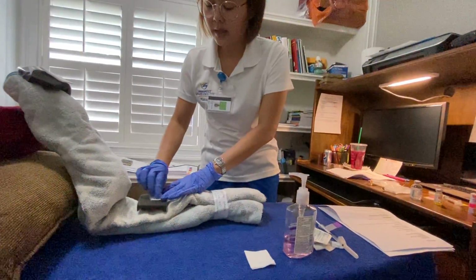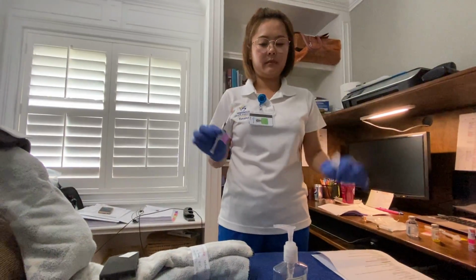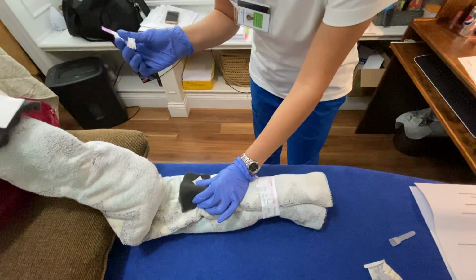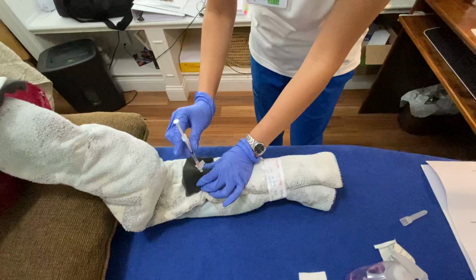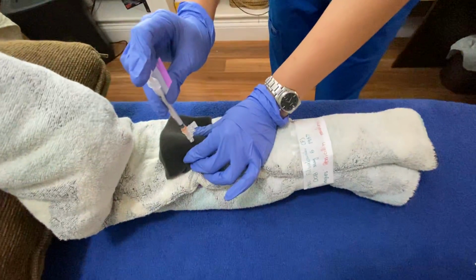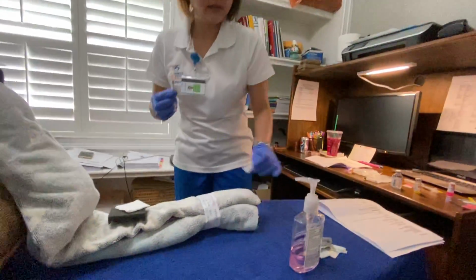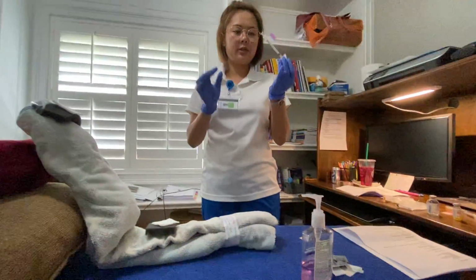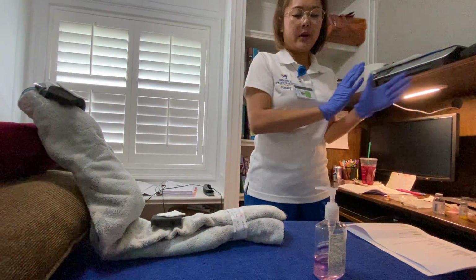So clean it outward again. All right, let it air dry. Okay, for this one, you're going to pinch the skin up 1 to 2 inches, and then you're going to go 90 degrees down. My patient is not a thin person, so I can go 90 degrees. So slowly, 5 to 10 seconds down. And then, all right, put the gauze there, and for the safety of the needle, re-scoop it, and then put it in a sharps container, and then clear my medical waste in the biohazard.